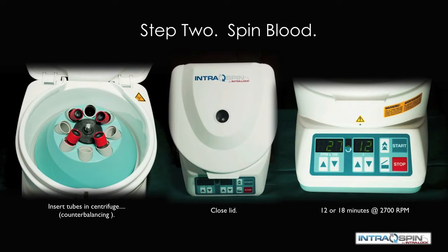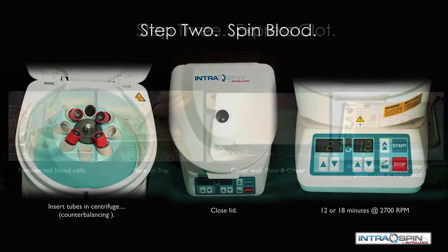The tubes are now delivered in a balanced fashion. We close the lid and spin for 12 minutes at 2700 RPM for the normal patient, or 18 minutes at 2700 RPM for the anticoagulated patient.